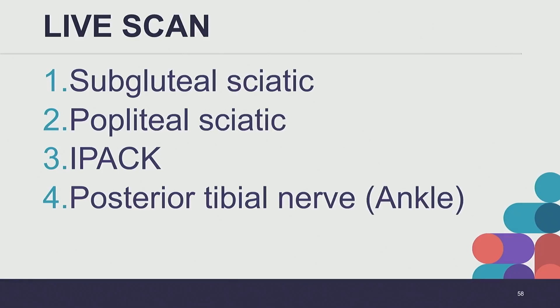All right, so you can see she's in sloppy lateral decubitus. We're scanning just underneath the gluteus maximus. This is the subgluteal approach.